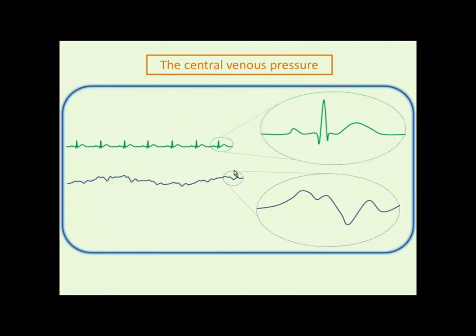Let's focus in on this cardiac cycle here and talk about the waveforms. So the first of the three positive deflections, there tends to be three positive deflections of the CVP and two negative deflections. The first is the A wave, and this is determined by, these are temporally in sequence here, atrial contraction. And electrical conduction precedes, usually by milliseconds, the pressure conduction within the cardiac cycle. So this is the increase in pressure in the right atrium as a result of the right atrial contraction.